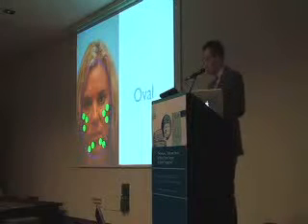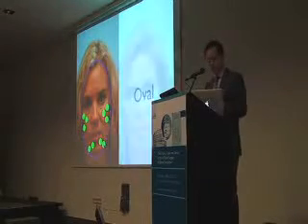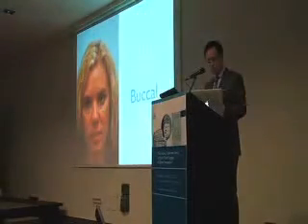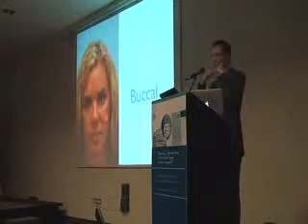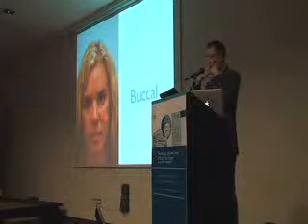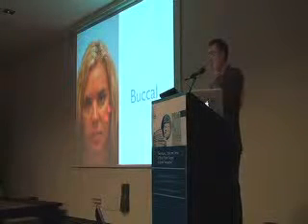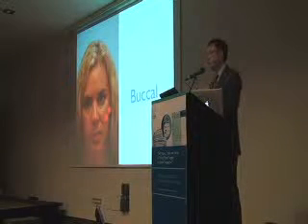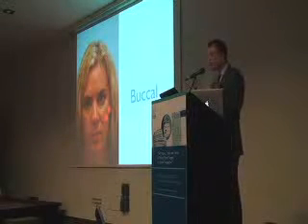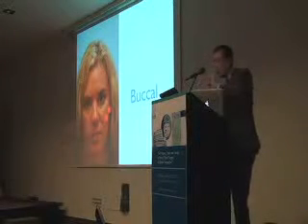So what is the objective? It's to create this oval, and you're going to try to help bring that into harmony. Okay, buccal. We talked about subdividing it. The central buccal is clearly where there's a depression right in the center portion, and that's probably the most obvious area we're going to talk about with buccal filling. But remember, when you see that scalloping laterally, when you're looking at a frontal view, and I encourage you again to focus on a frontal view for a patient, because that is what's most important. Whenever I sculpt, even if I'm using fillers, if I'm on the side sculpting like this, I'm always coming back and looking at the front.